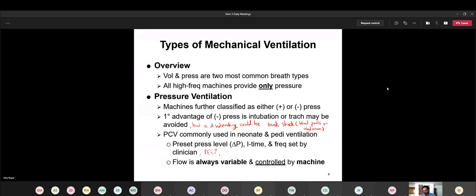And then I'm going to write pressure support, but I'm going to put a little asterisk here. Because we know if you're doing pressure control SIMV, you can add pressure support. But if you're doing pressure control assist control, it's invalid. There's no pressure support that you can set in a mode that's not spontaneous, or a mode that does not allow spontaneous breaths to happen.